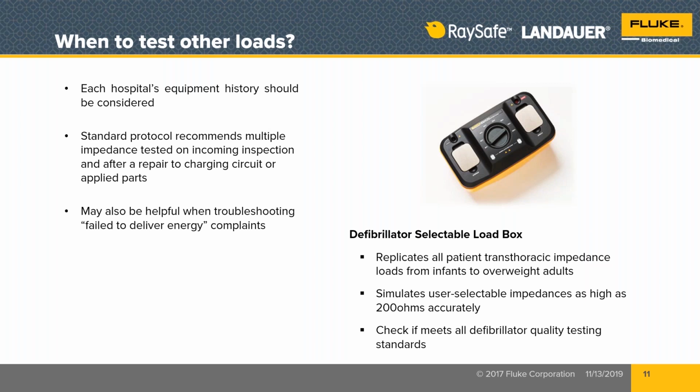across the available defibrillator analyzers today, including ours, there are external loads that can be used so that when you're testing the defibrillator, you're able to also test this functionality by keeping the output energy setting at a particular setting and then testing it across more than one of those load values. So you can see that what you end up with is what we call a flat response.